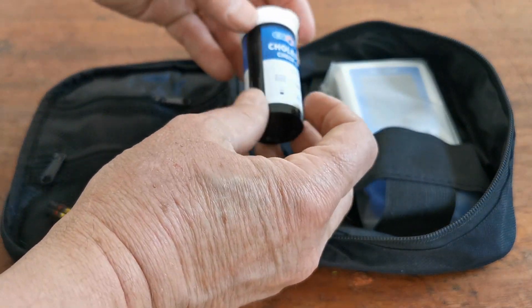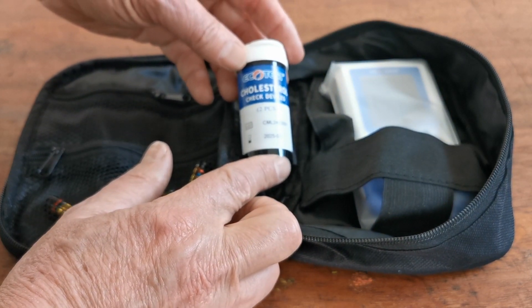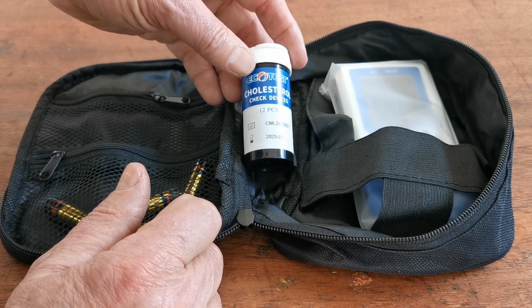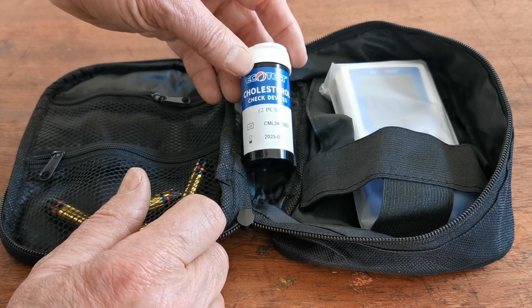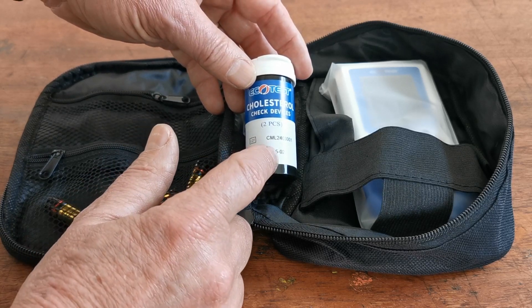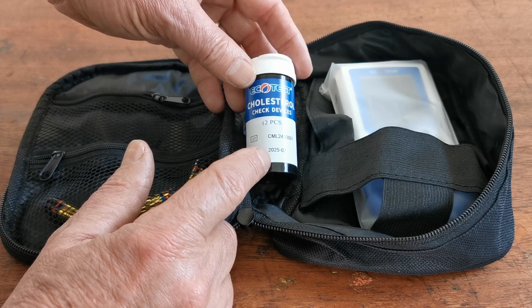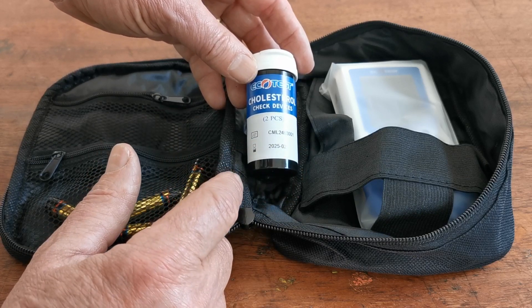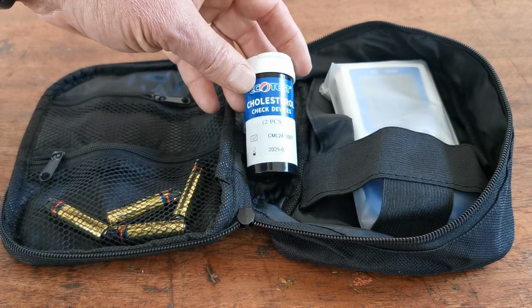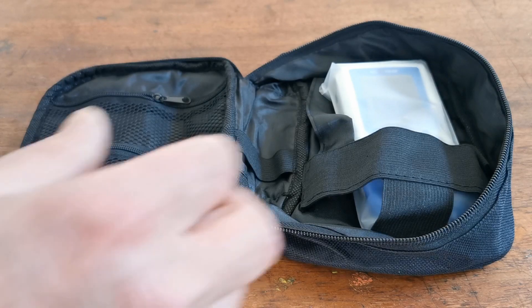Regarding the check devices: there's no need to use these when you first get the meter. These are optical check devices testing the function of the digital meter. They can be used if you have any concerns about the accuracy at any time during its life. They have to be used within 12 months of the seal being broken — they can be used multiple times, but once you've opened them, do write the time and date so that you only use those for 12 months afterwards.